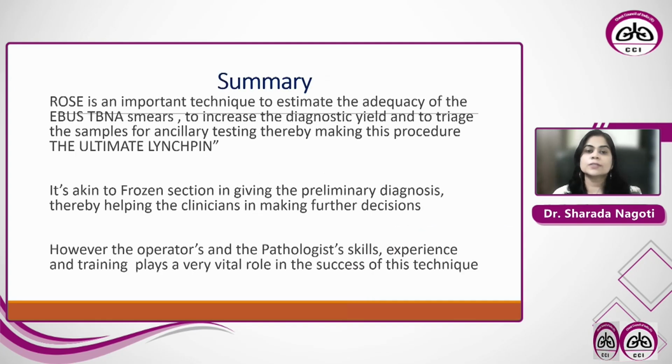So to summarize, ROSE is an important technique to estimate the adequacy of EBUS TBNA in smears, to increase the diagnostic yield, and to triage the samples for ancillary testing, thereby making this procedure the ultimate linchpin. It's akin to frozen section in giving the preliminary diagnosis, thereby helping the clinician in making further decisions.